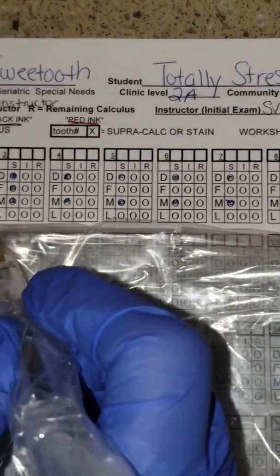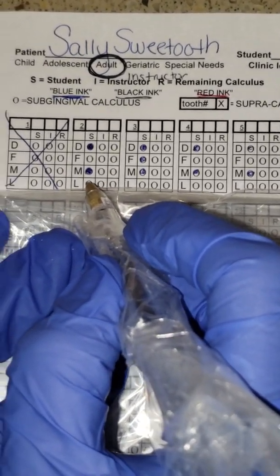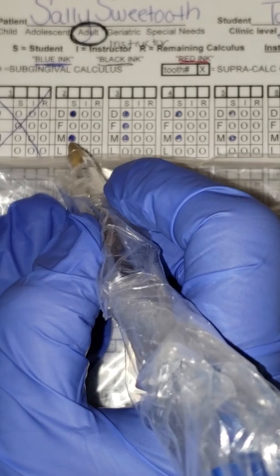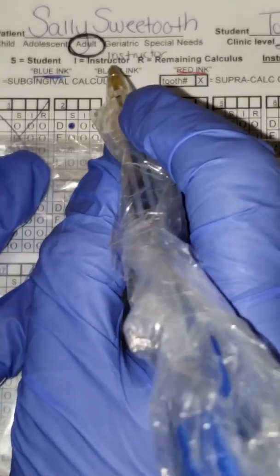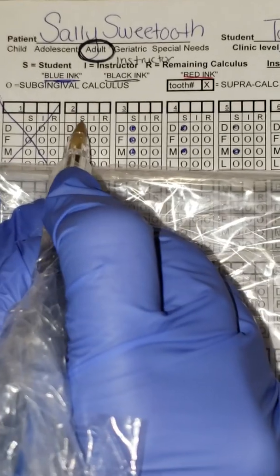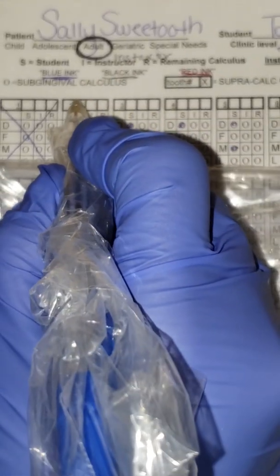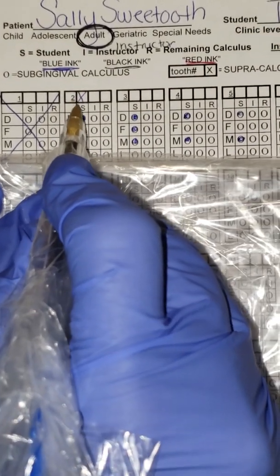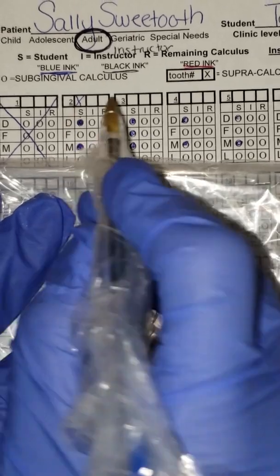I also, as I'm assessing, am going to use my air and my Explorer to detect supragingival calculus. So this is going to be recorded in this box here. Again, right above the S, that's the student. If number 2 had some supragingival calculus or stain, we're going to just put an X.